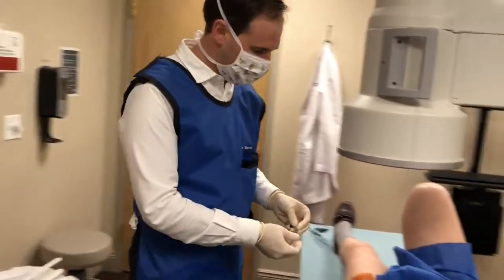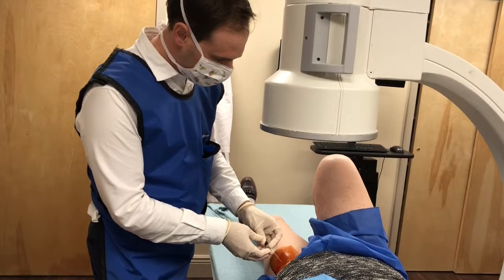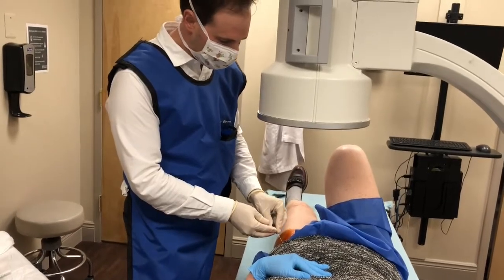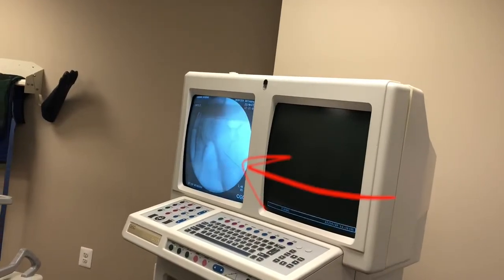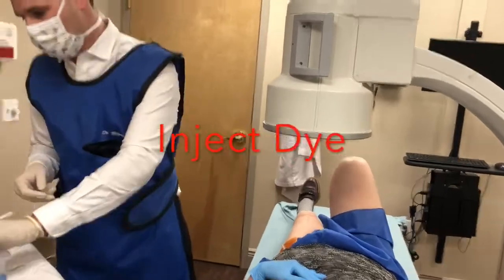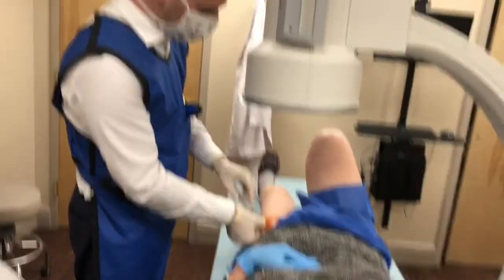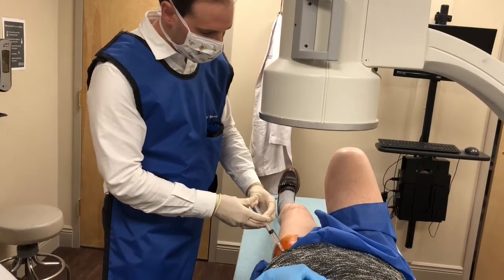Now we're ready for the needle that goes down to the hip joint. We take a couple of x-ray shots here — again making sure that we get the spot we want. We place a very small amount of dye that you can only see on the x-ray machine, which gets reabsorbed by the body very quickly, to further confirm that we're right where we want to be.